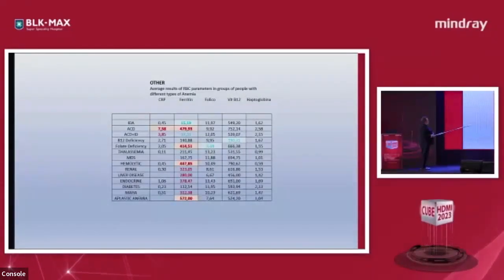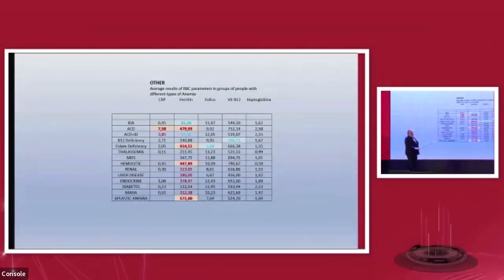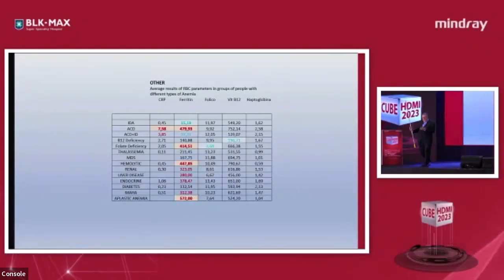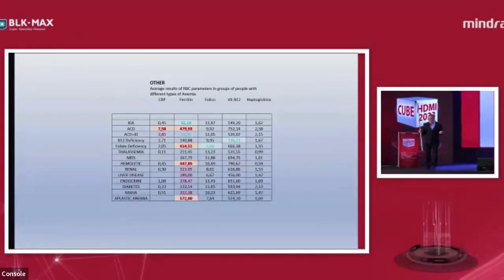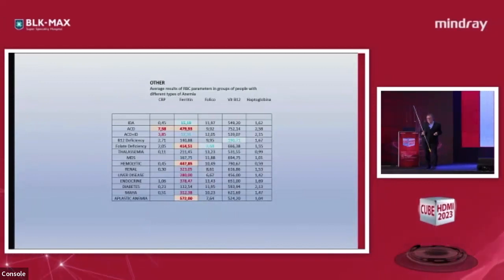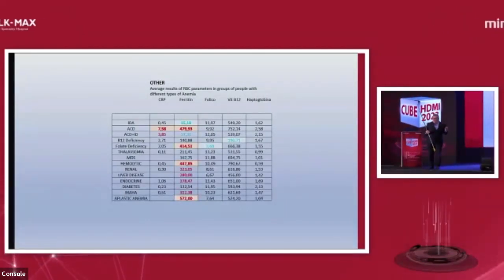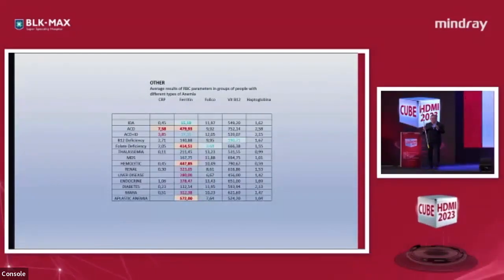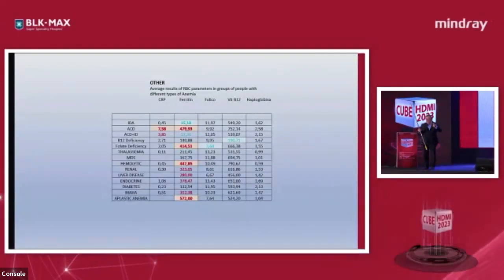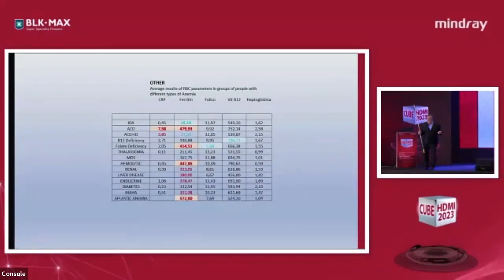And finally, I decided to use CRP and ferritin. Here I have a difference. We don't have to divorce from the immunochemistry. They are our friends. We have to work together. We are better together. IL-6, ferritin, transferrin, CRP, why not? We don't have to do everything ourselves. We need to flag, we need to forward, to reflex, but we need them. We can assess the functional iron deficiency, yes. We don't have iron available, yes. Hypochromic red cells, CHR, perfect. But we need to do an inflammation marker and we need to check immunochemistry.